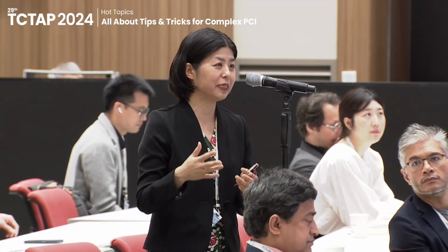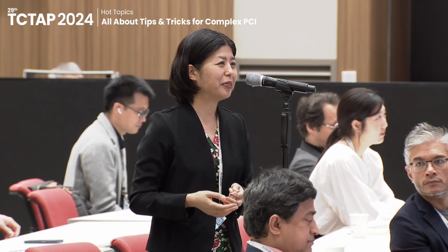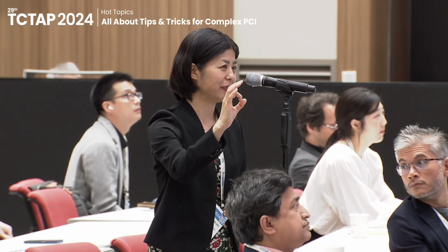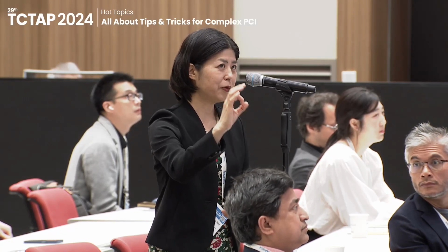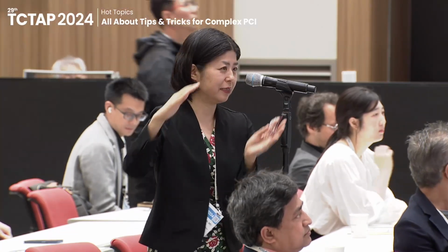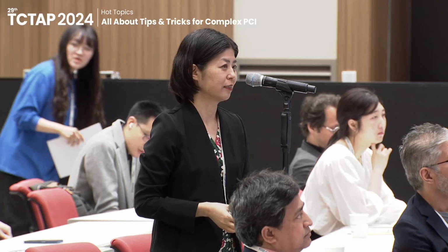I think so. A long time ago, when I was in Japan, I was taking the CT by myself, and I scanned so many hemodialysis patients. We see the calcified nodule in the lumen, and that actually has lower density, or lower Hounsfield units, compared to the other dense calcium. And I think we can diagnose it by CT for sure.